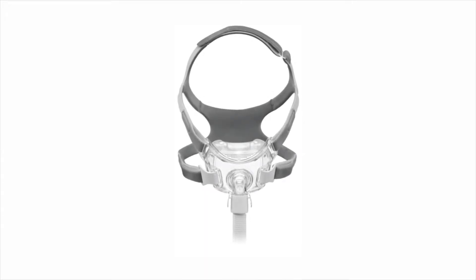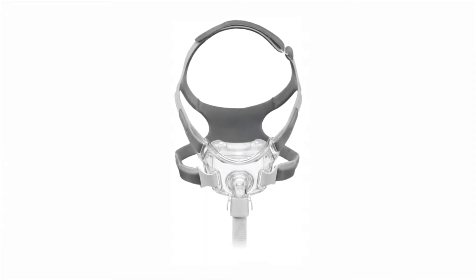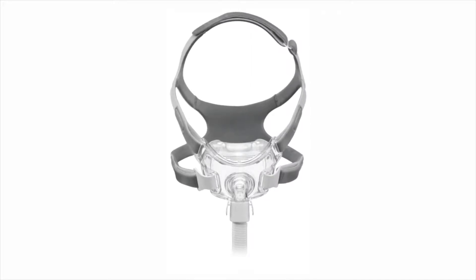Cleaning your AmaraView mask frame, cushion, quick-release tubing and headgear before the first use is very important.